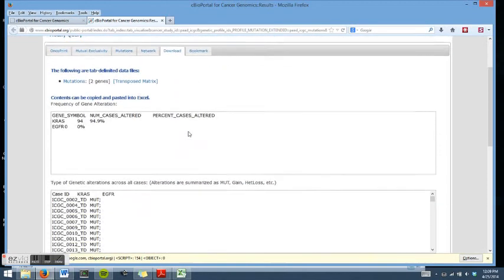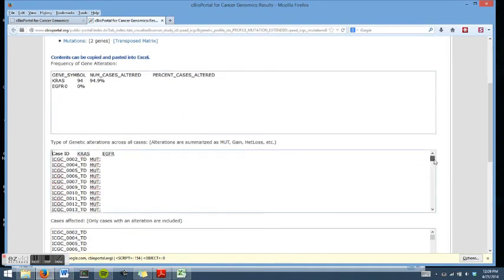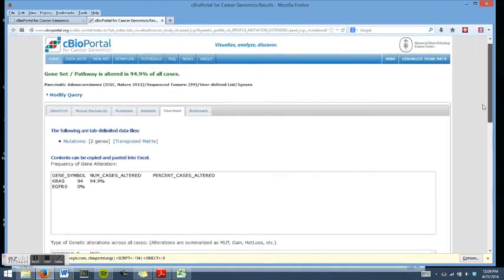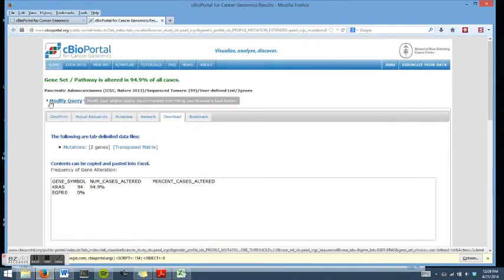You can download a summary of all these things. However, you could have just saved all those previous figures as PDFs, but nonetheless, if you want a text format, a tab-delimited kind of thing, you could just copy-paste these into Excel or something. But that's pretty much it.